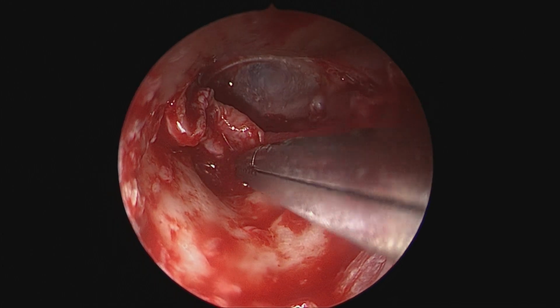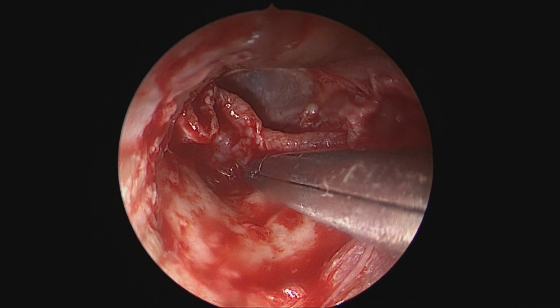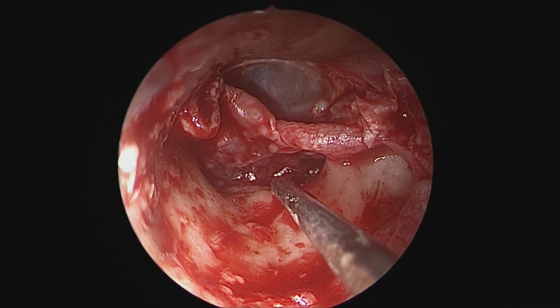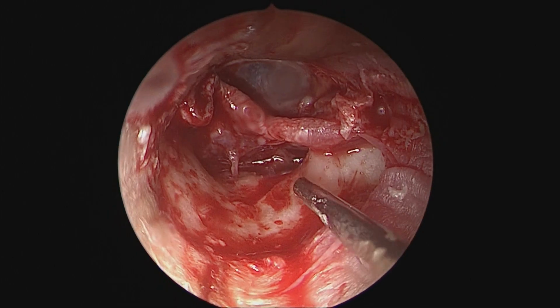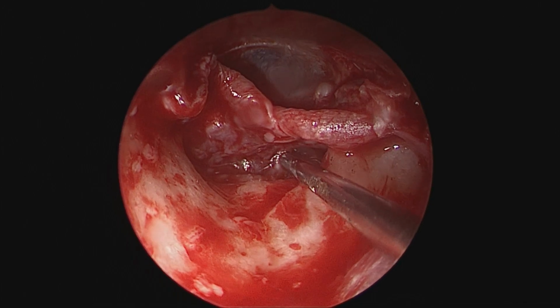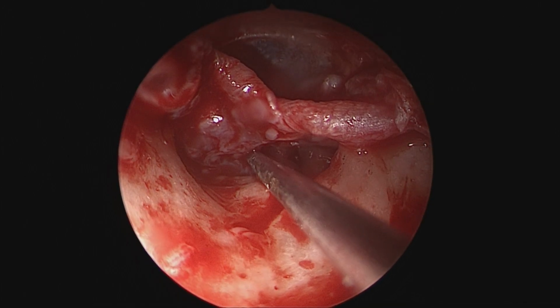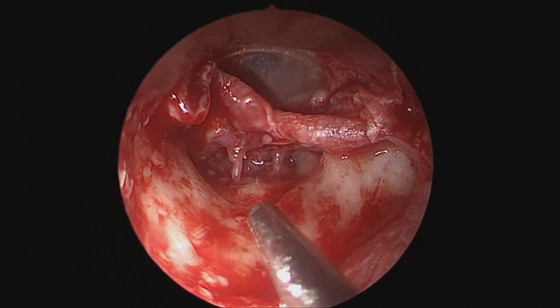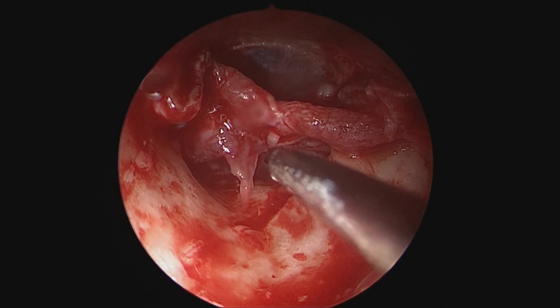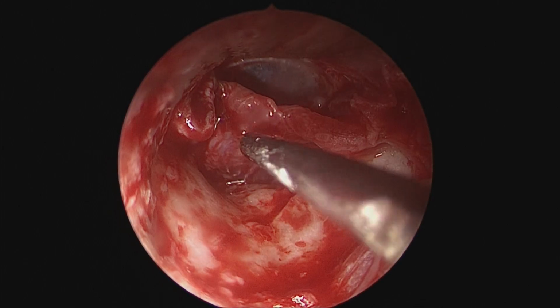So again, the inferior part of the tympanomeatal flap is yet to be elevated, and as you see, almost the entire posterior mesotympanum is filled with the polypoidal granulation tissue that has to be removed, as well as closely inspected for any evidence of squamous epithelium. We can already see the stapedius tendon and the pyramid.